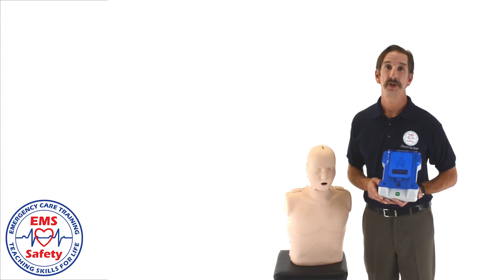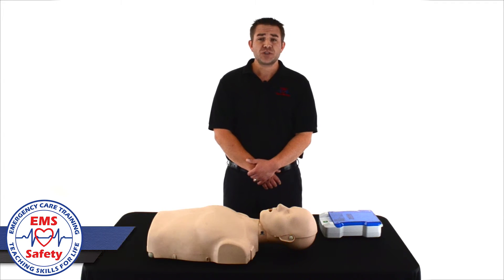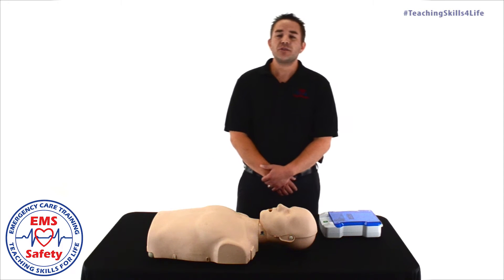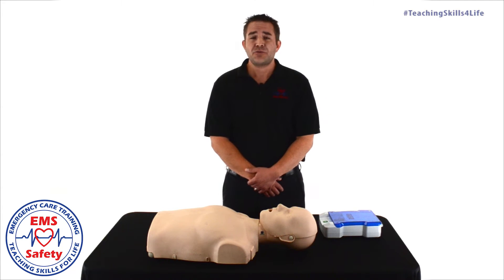Now let's turn this over to John so we can see how it's done. Hello, I'm John Hebert, I'm an instructor with EMS Safety Services, and today we're going to teach you how to properly use an AED. All AEDs are going to follow the same basic sequence: power on the AED, apply the AED pads, and follow the prompts.